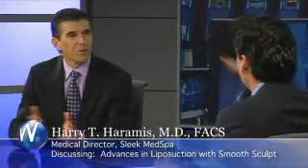But why lower downtime? That's the part. Help me understand that part. Well, I've asked before, but I want to know. Remember what we're doing? We're putting the numbing fluid in, small cannulas. The ultrasound is going in, it's breaking up the fat, smaller particles, it's less traumatic to the patient.